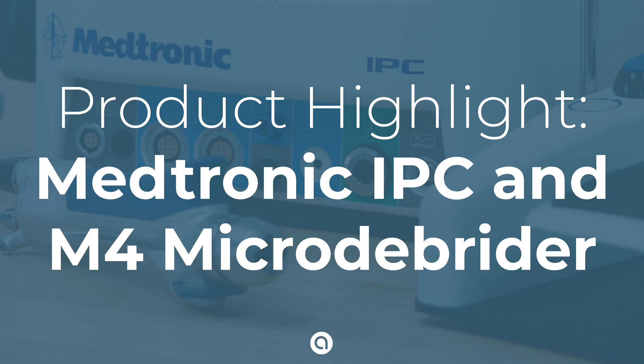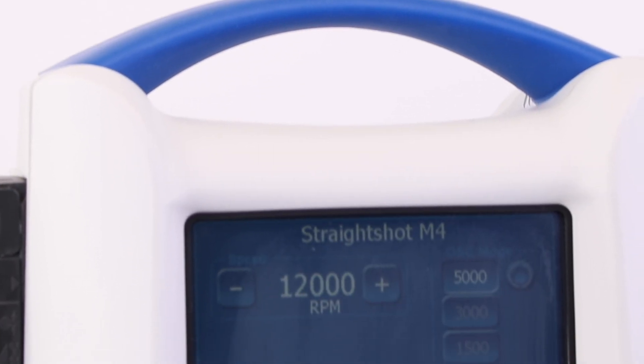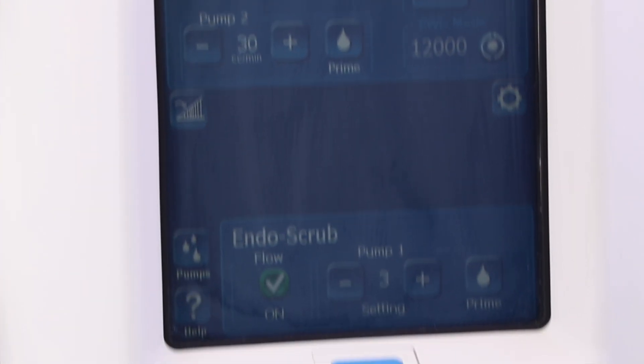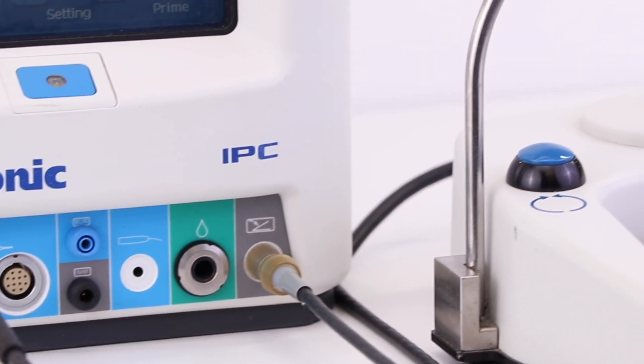Hello and welcome to AA Medical's product feature on the Medtronic Integrated Power Console set. The multi-specialty Integrated Power Console powers tools used to remove soft tissue, hard tissue, and bone during ear, nose, and throat surgeries.